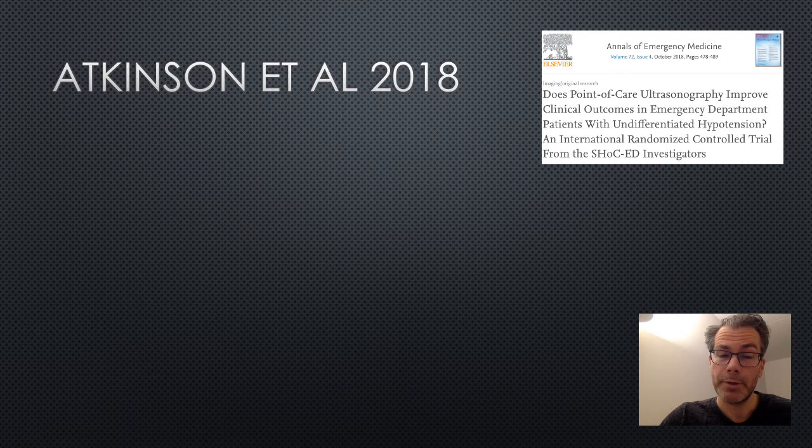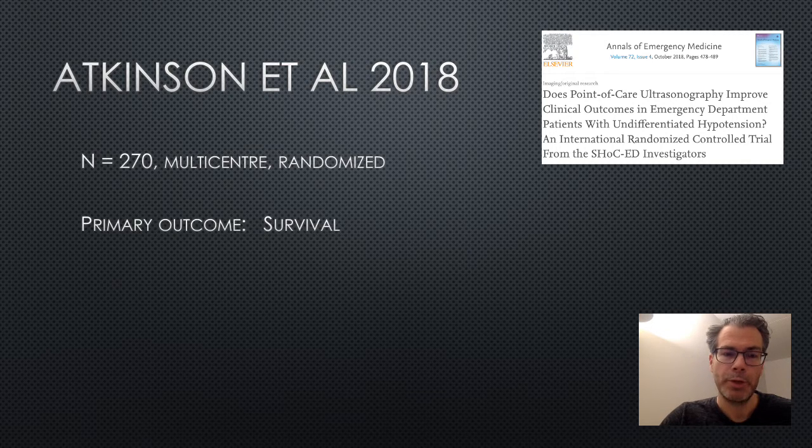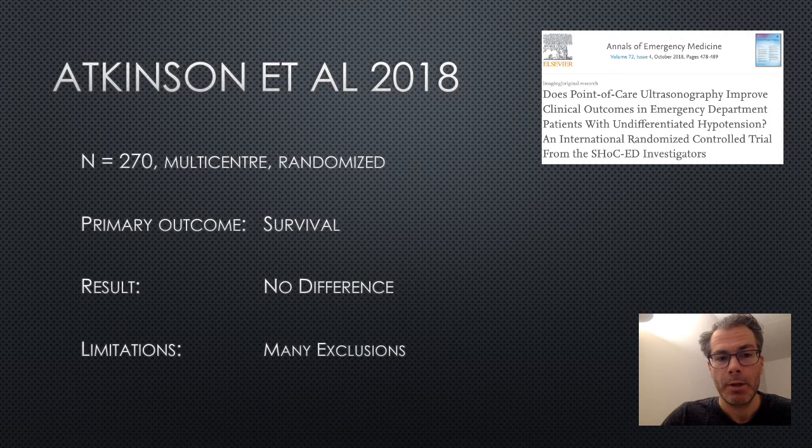Then the year after this, in 2018, Atkinson and his colleagues performed a larger multi-center trial looking at whether point-of-care ultrasound for undifferentiated shock actually conferred a survival advantage. And the result was that no, it didn't. There was no difference. However, there were some limitations with this trial.